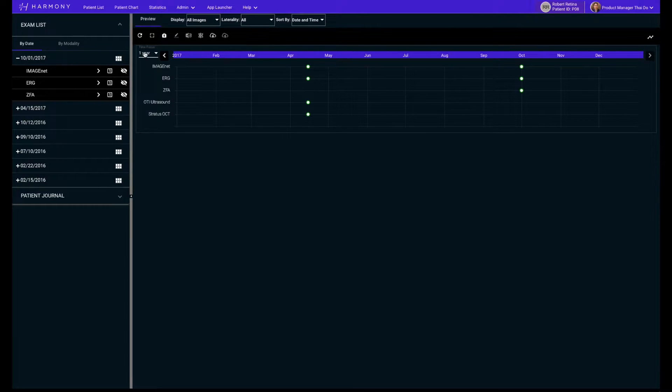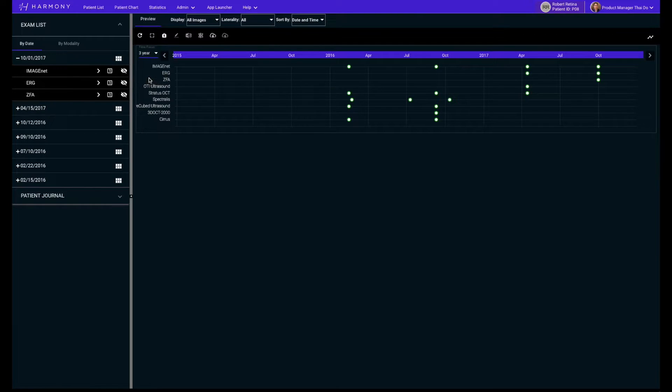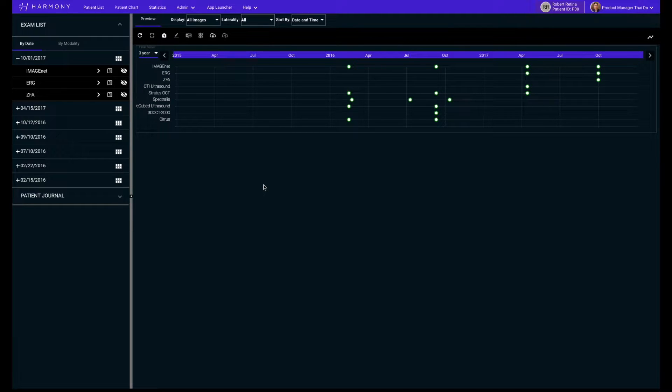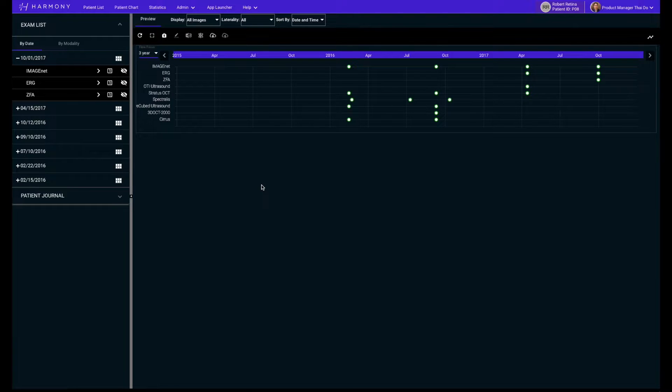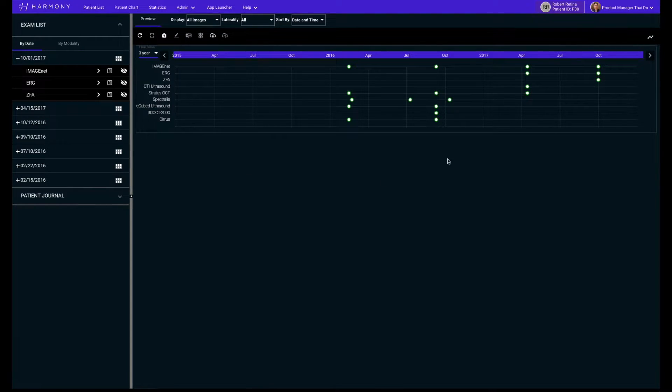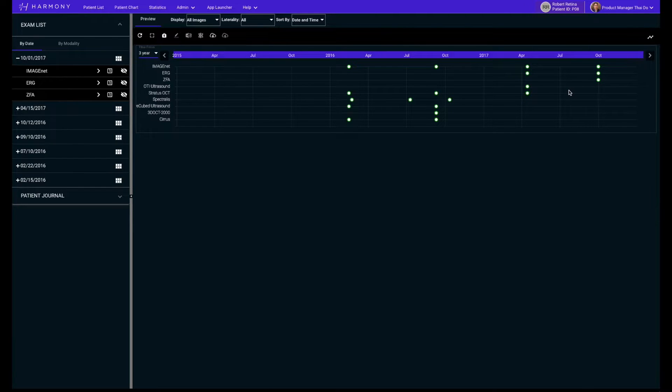On the left side of the timeline graph is a list of every device that has been used to capture data for this patient within the selected time period. Using the timeline graph, you can see that this patient hasn't had an OCT recently, so they should be due for one today.